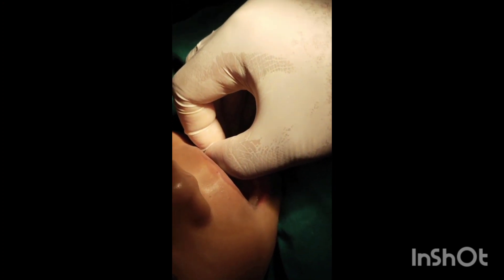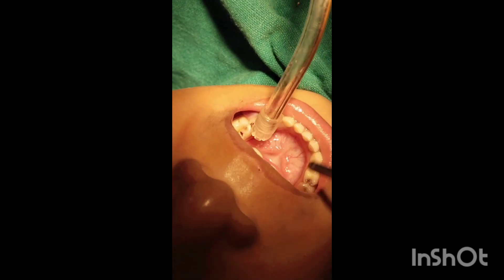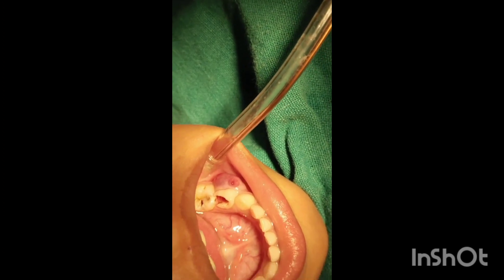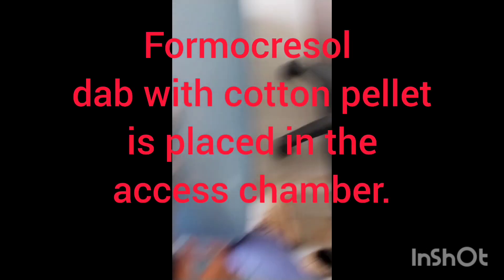Okay. Now, you place the... Okay, fine. Okay. That's it. I'll give you a quick check.